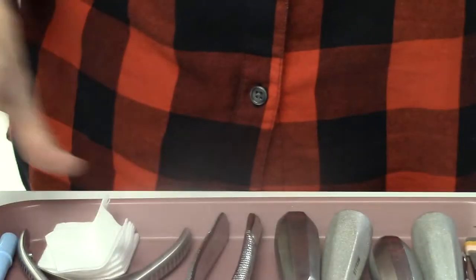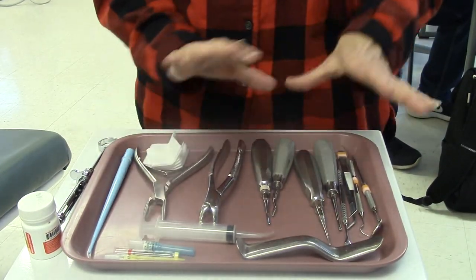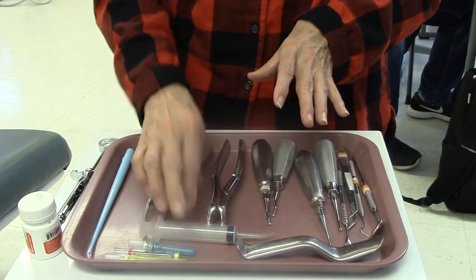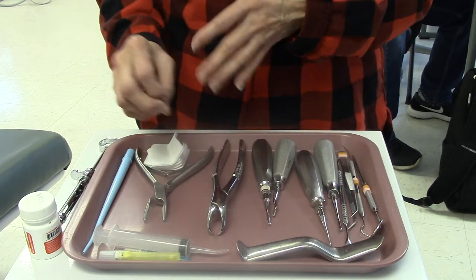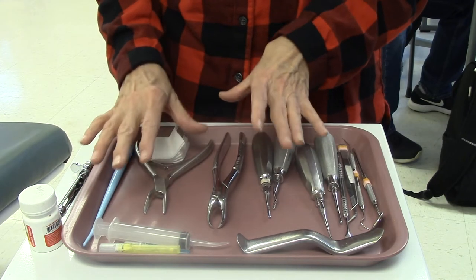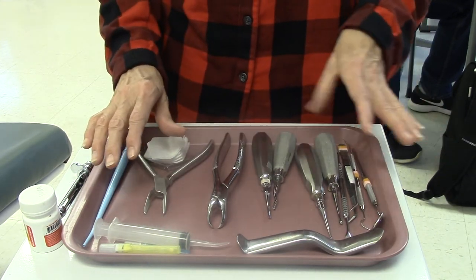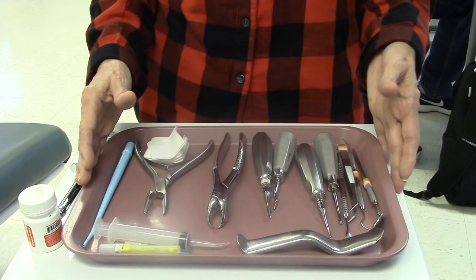This is a complete simple extraction tray. The only thing that changes on this tray is the forceps you're going to use — it would be different if you're doing an anterior or a primary tooth, so the forceps are really the only instrument that would change. Never open up all these instruments until you know you're going to reuse them, because you don't want to have to re-sterilize them. Thank you.